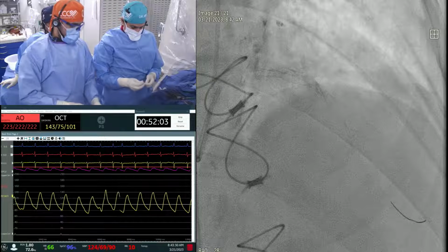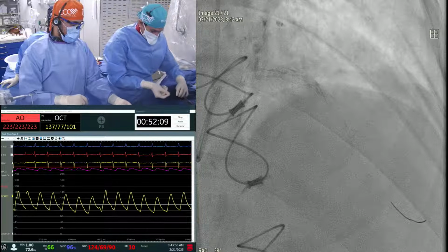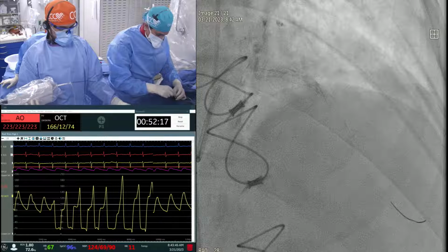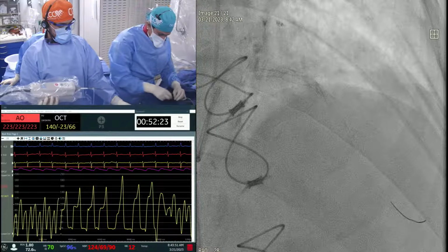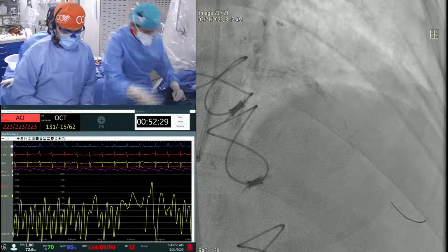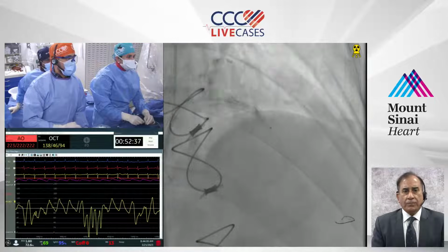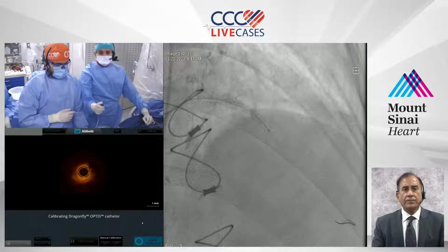But the drug-coated or drug-eluting balloon is taking a big wave in Europe and other places. Probably in India also, with this new company, Vascular Concepts, I think that's the name. I was wondering if you saw any of their cases at the India Live meeting. Yeah, at the India Live meeting, there was one case of the drug-coated balloon shown. There were many cases of IVL shown. And Anu relayed the case of the rotablation, the only case of rotablation among the 34 live cases which were done. Of them, 12 were structural cases.